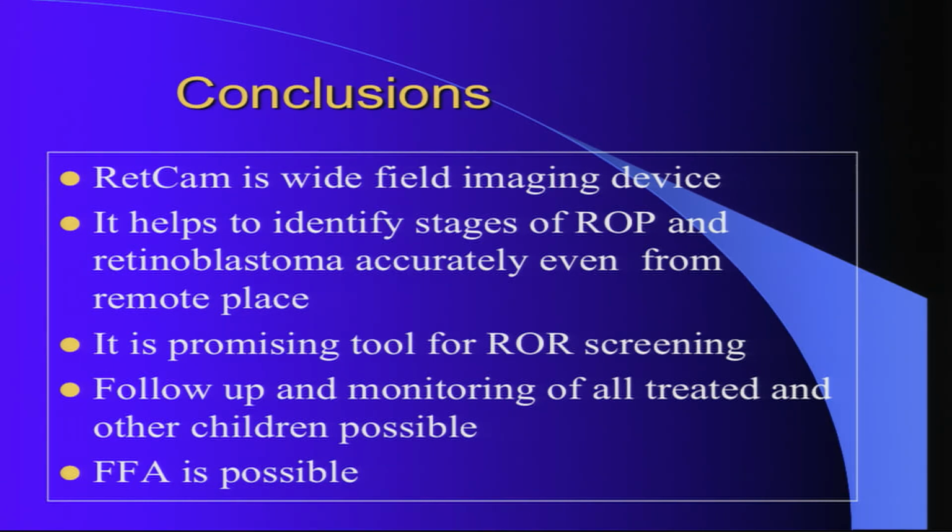I already talked about the Anand tele-screening program. Follow-up and monitoring of all the treated and other children is possible, and you can demonstrate it nicely. And you can also show it to the parents and to your students. I have shown some of those cases, and fundus fluorescein angiography is possible.